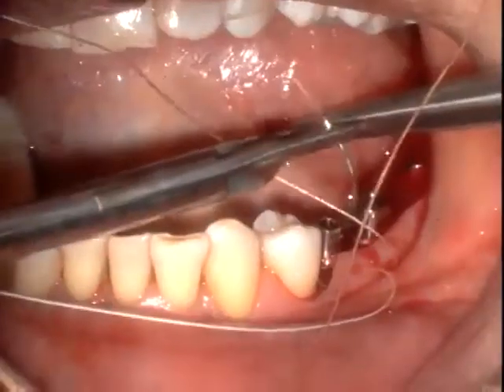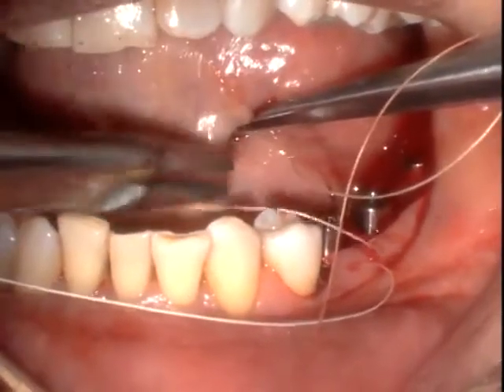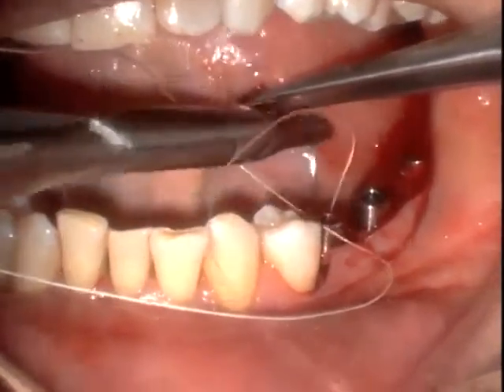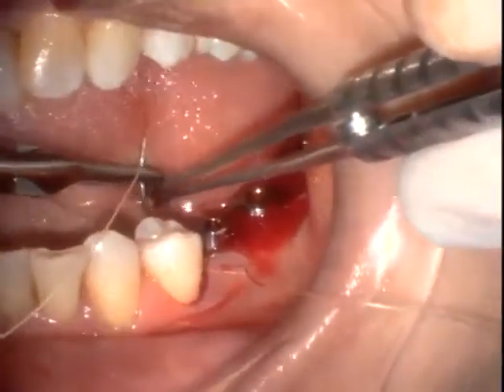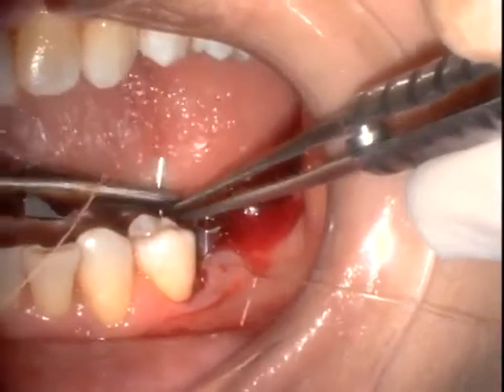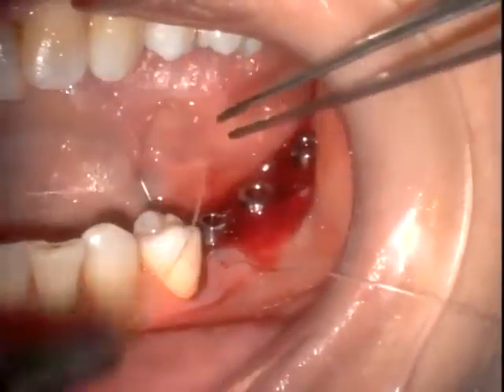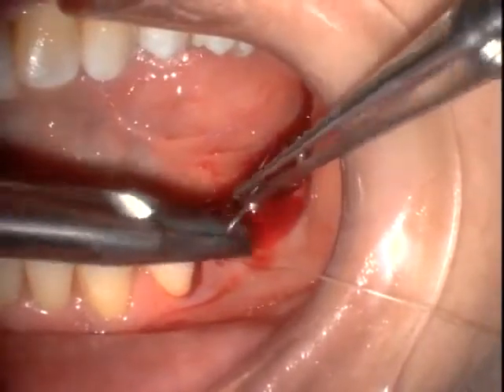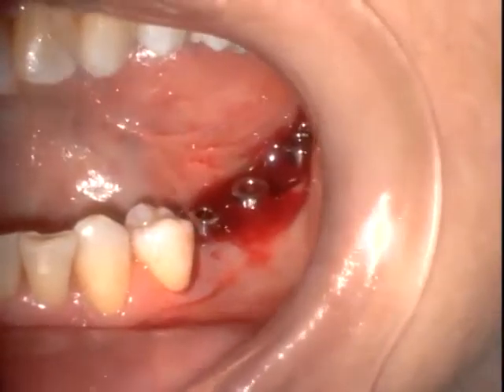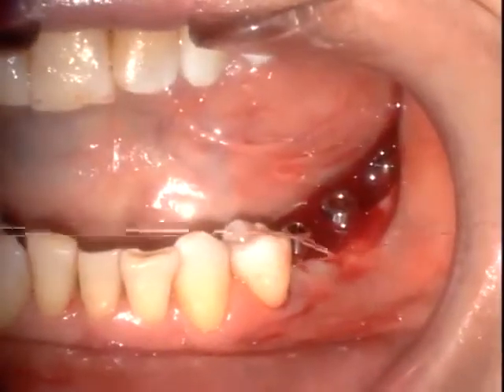I'm a big fan of utilizing the interrupted vertical sling mattress sutures whenever I'm going to reposition the keratinized tissue on the buccal aspect. I use this whether I'm going to position the tissue coronally or whether I'm going to position the tissue apically. So I can take that keratinized gingiva that was more towards the lingual, and then utilizing the sling sutures, I can then position the keratinized tissue towards the buccal aspect of the permanent abutments.